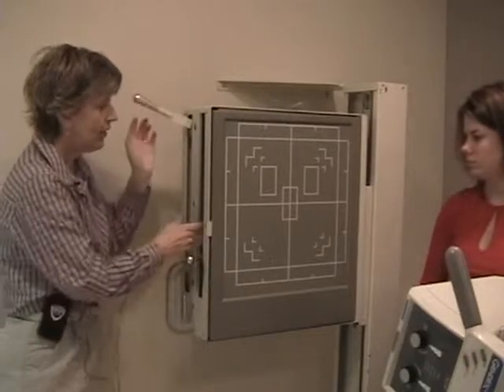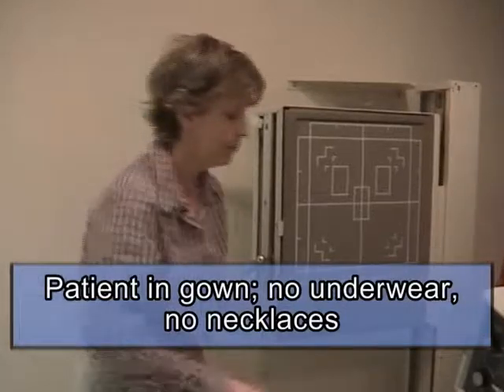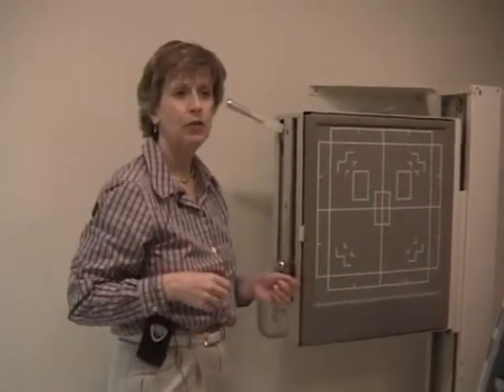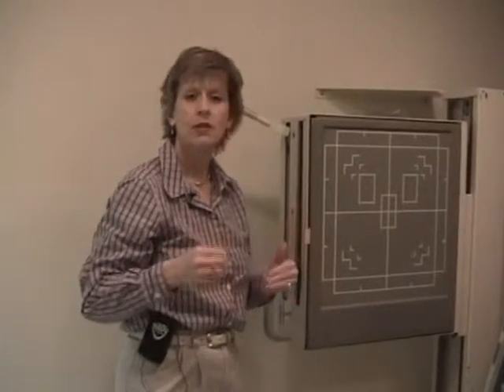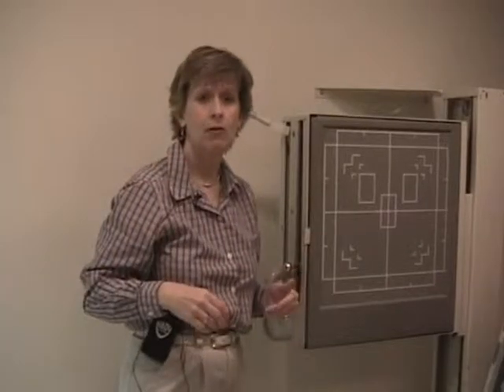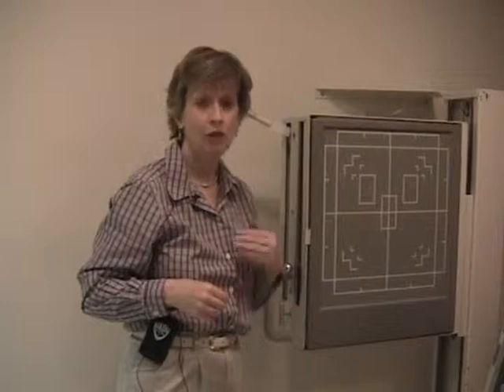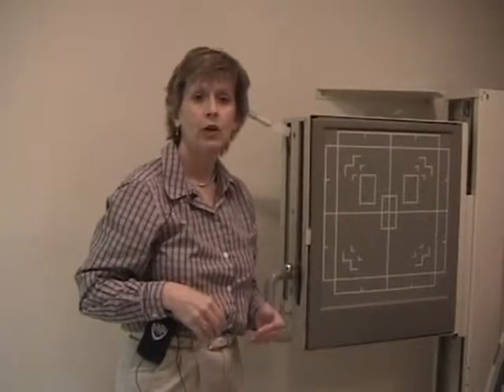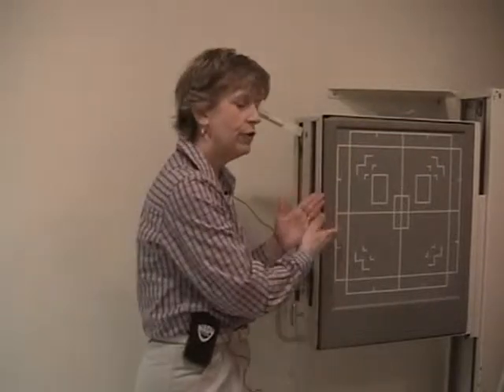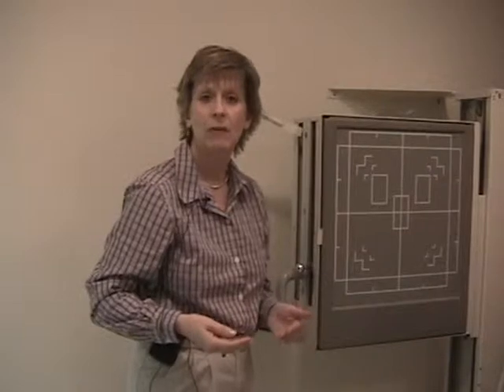Your patient is dressed in a gown, no underwear, no necklaces. We're going to do it at the vertical board because it's easier for the patient to stand. It's quicker rather than lying them down. The muscles helping them lie down, clavicle can be in pain. But what about a patient who's in shock, who might faint on you? You would be forced to do them in a recumbent position. Whether you do it vertical or recumbent, the criteria is exactly the same thing.